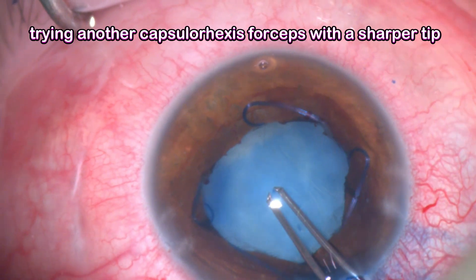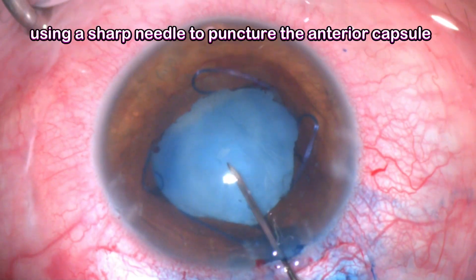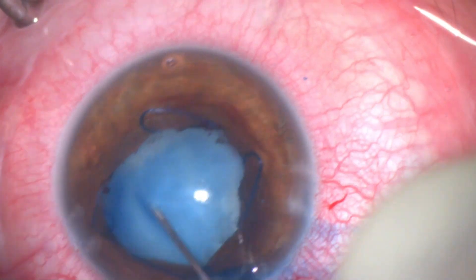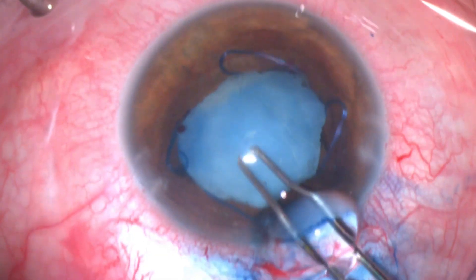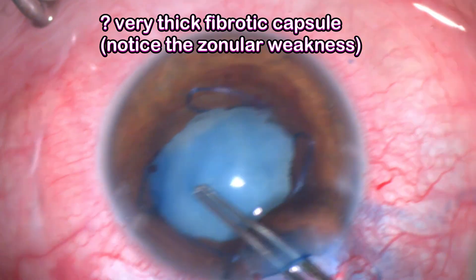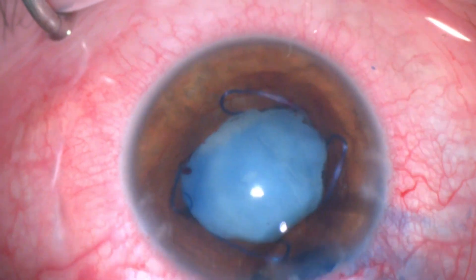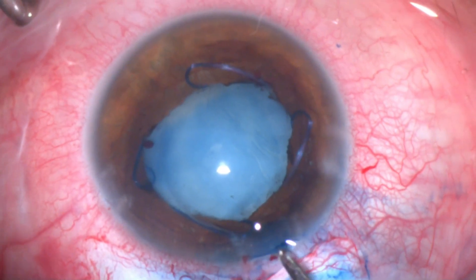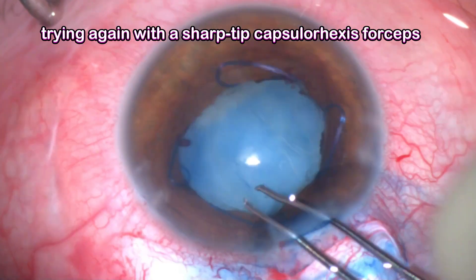When I tried to hold it with capsulorrhexis forceps I couldn't open it — I tried multiple times. I then moved to try a sharp needle tip, then grasped it again with the capsulorrhexis forceps. The capsule is very thick and fibrotic, and any trial to open it stresses the already very weak zonular complex.